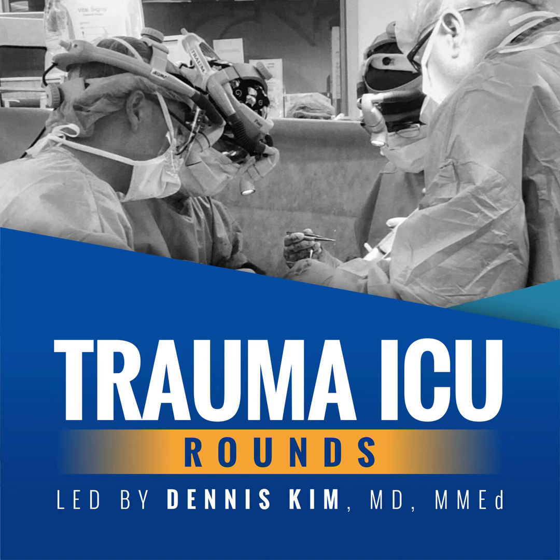On the opposite end of the spectrum are spontaneous breaths, or breaths for which the patient controls both the timing and tidal volume. The delivered volume, pressure, or both are determined by the patient's demand and underlying characteristics of the respiratory system, namely resistance and compliance. And just as a reminder, resistance and compliance make up the load against which the ventilator, or in the case of spontaneous breaths, the respiratory muscles, must work to deliver air.